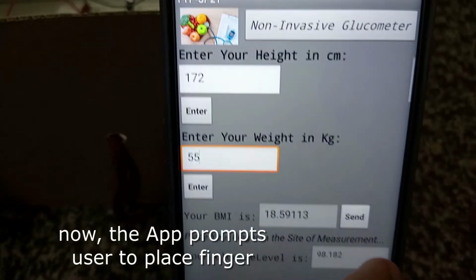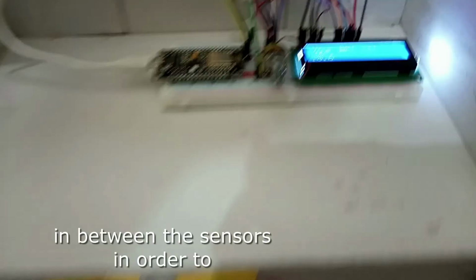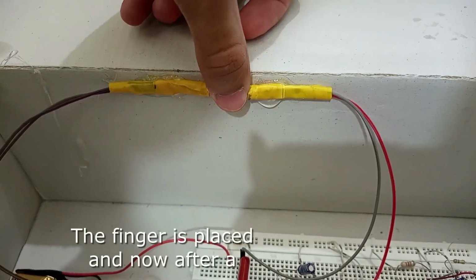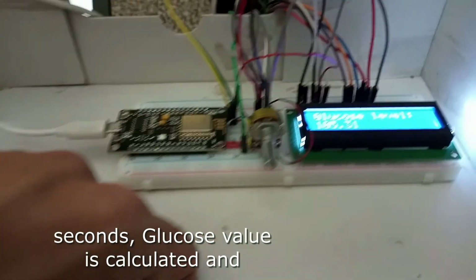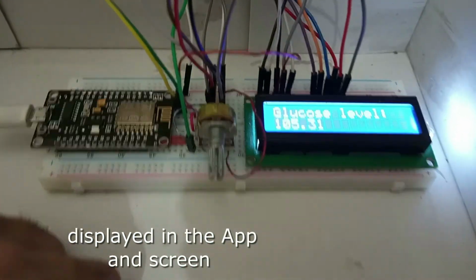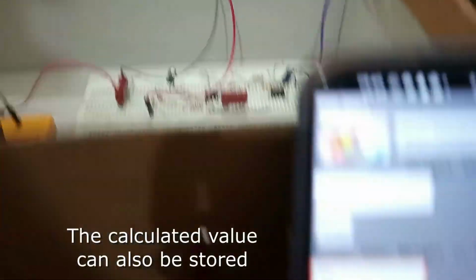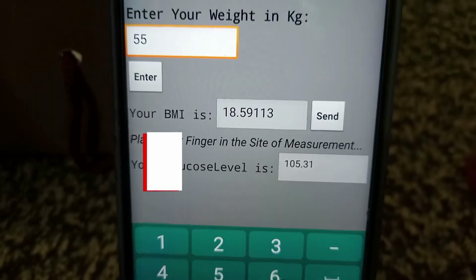Now the app prompts the user to place a finger in between the sensors in order to calculate his glucose level. The finger is placed and now after a few seconds the glucose value is calculated and displayed in the app and on the screen. The calculated value can also be stored in the mobile along with date and time and can be viewed anytime.